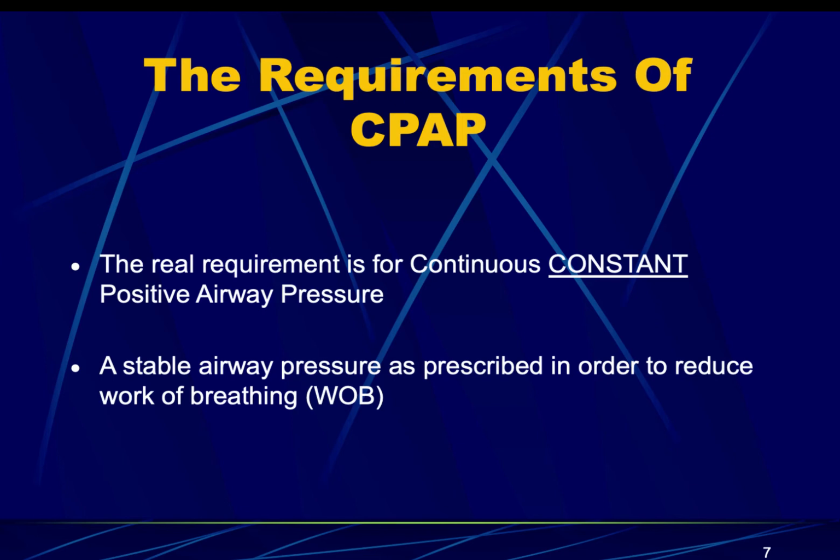We're using it to help force the fluid out of the lungs, so push it down in order to recruit that alveoli for patients that have left-sided congestive heart failure or possibly even a pneumonia. We're using it for asthmatics to help deliver the medication a little bit better. But really, we can use this for anybody that is suffering from a low oxygen saturation.